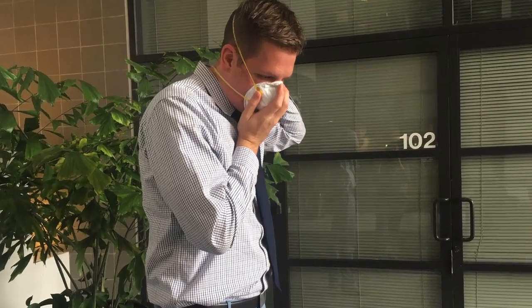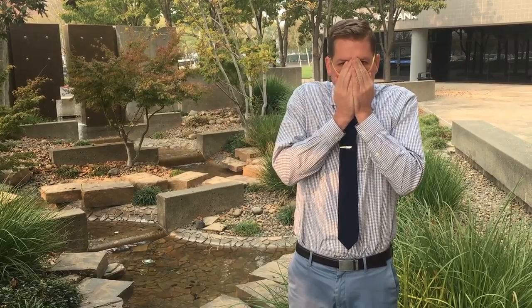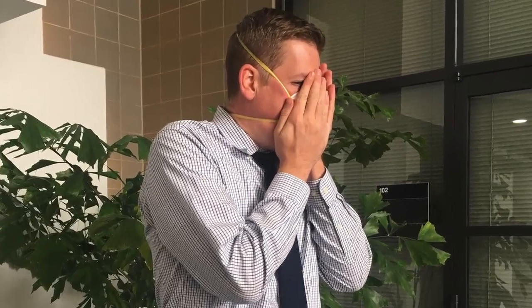Then you're going to take your hands and push the nose piece down. Then, to do a user seal check, you're going to take your hands, cover a lot of the filter, and breathe in. As you do so, you can feel any leaks around the edges that may need some adjustment on the respirator.